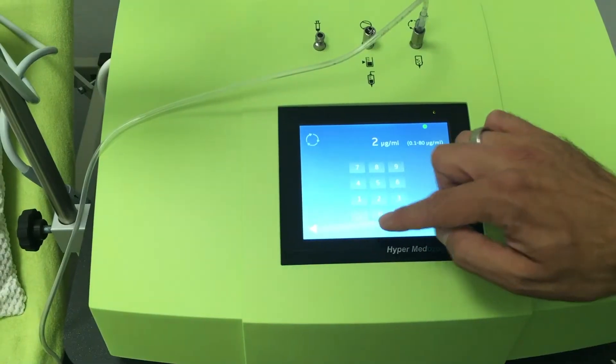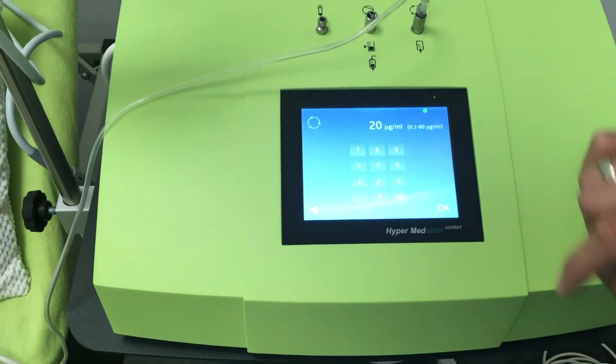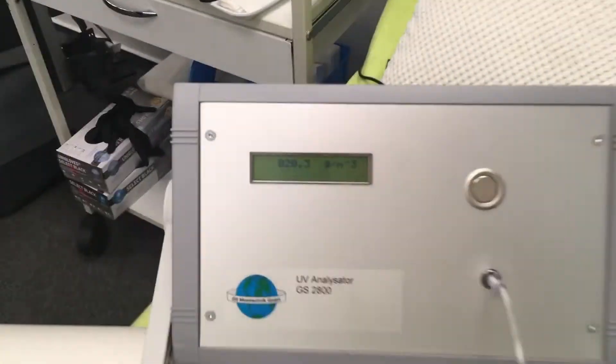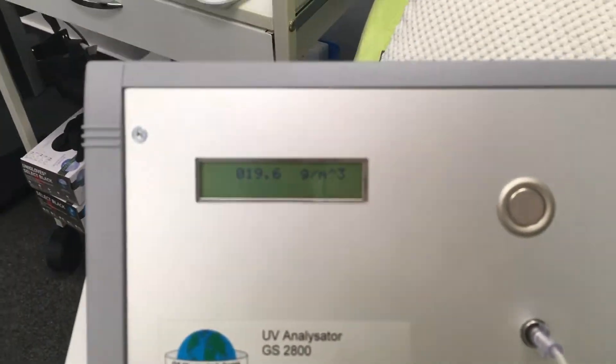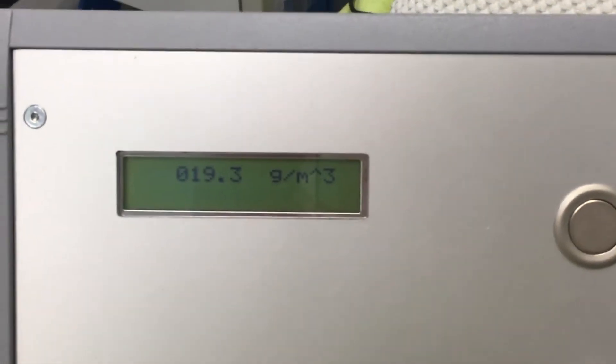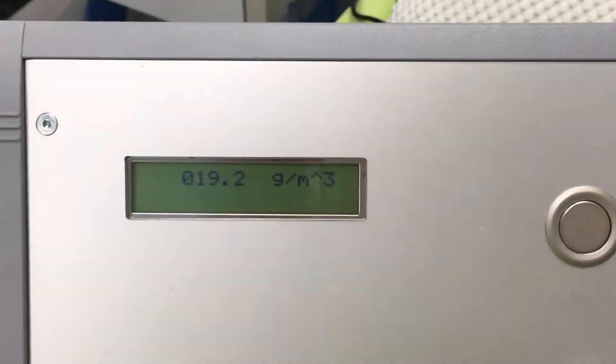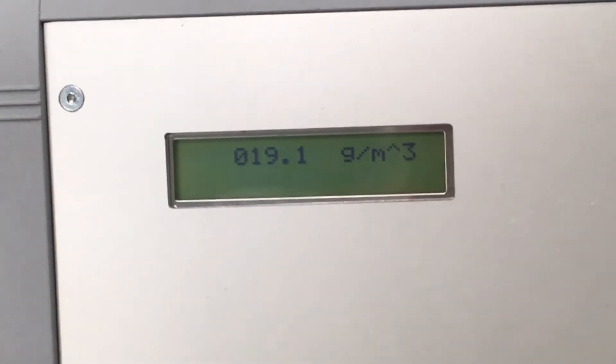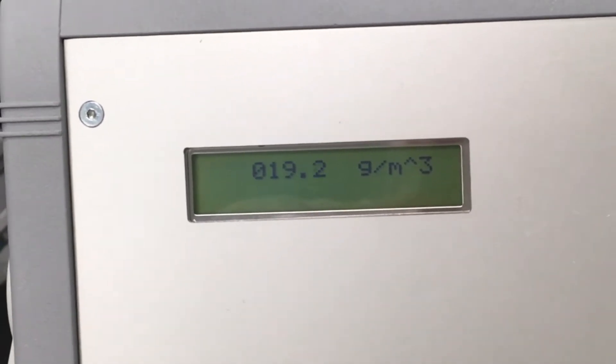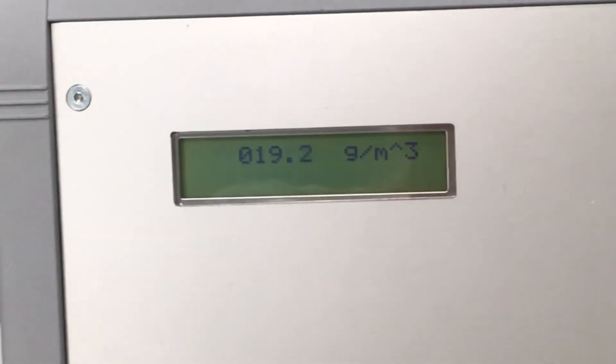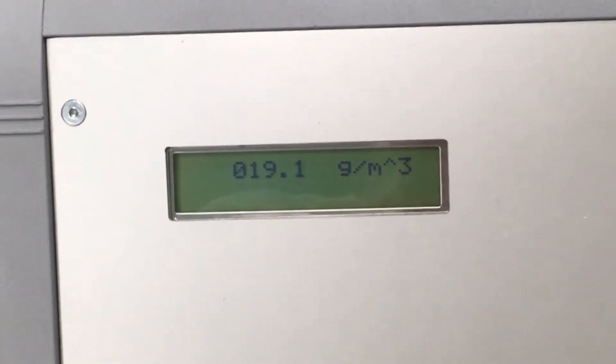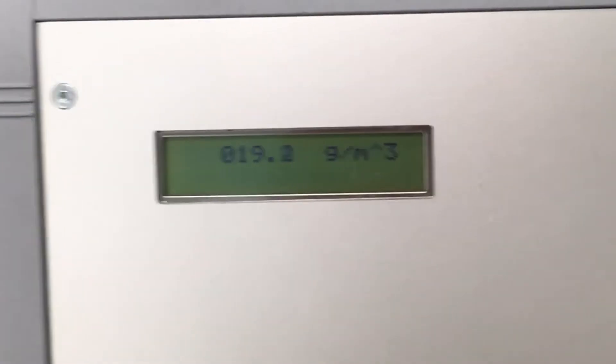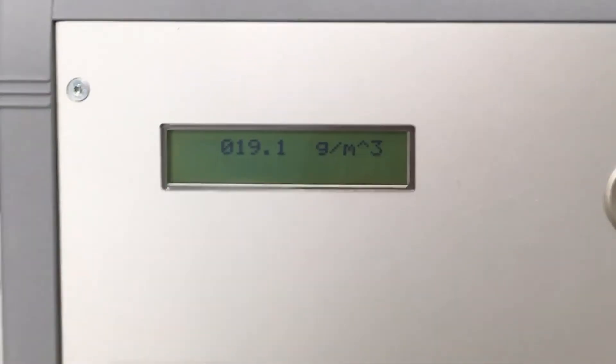Now we used a different ozone analyzer and we set it to 20 micrograms per milliliter. The results were 19.2, 19.3, 19.4.